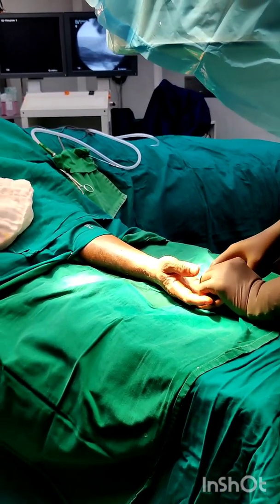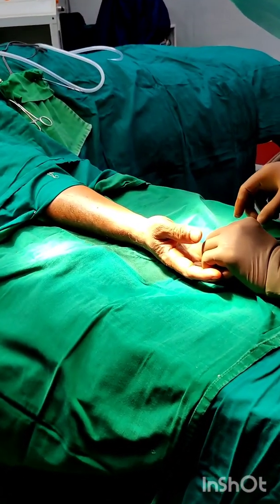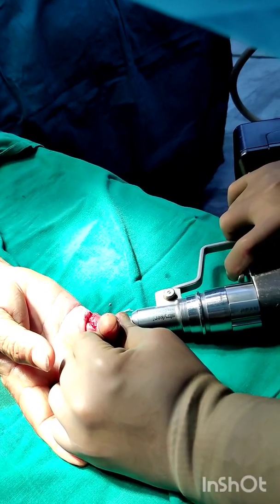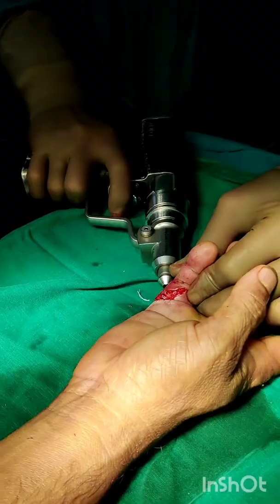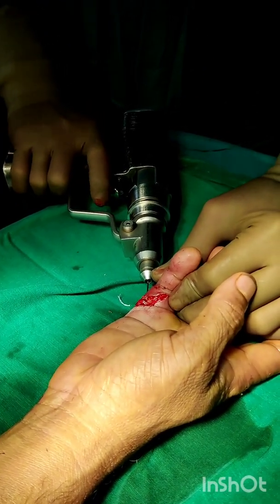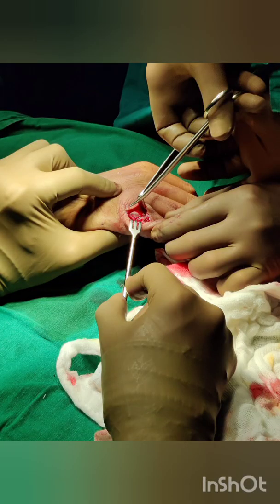This patient underwent close reduction and K-wiring of the metacarpal and the distal phalanx of the little finger as well as tendon repair with tourniquet over the arm for 2.5 hours. Patient was comfortable with IV sedation using IV 2 mg midazolam and dexmedetomidine infusion along with supraclavicular brachial plexus block.